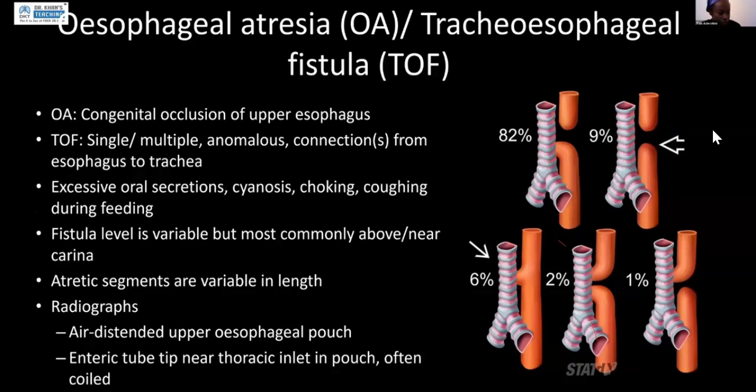So we've looked at the radiographic findings already, so I won't repeat them because I think I've said them many times already.